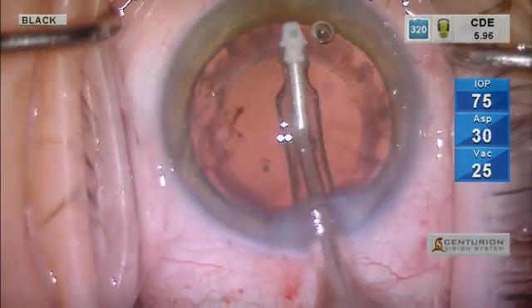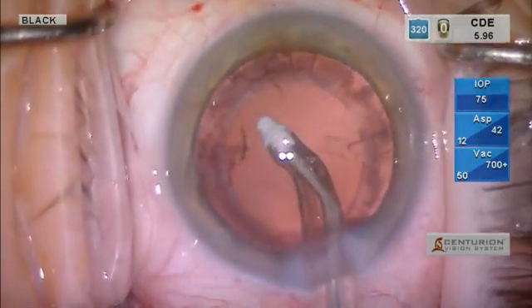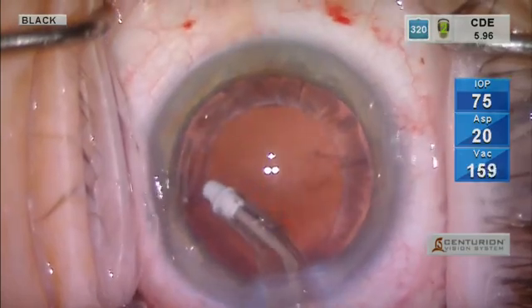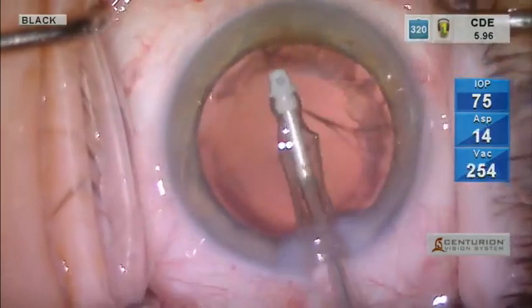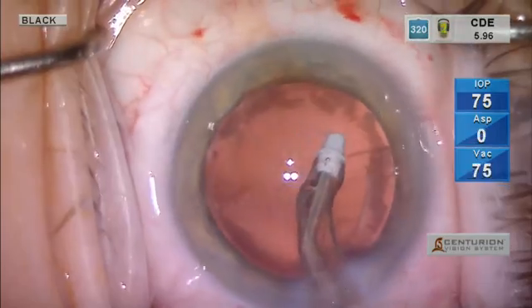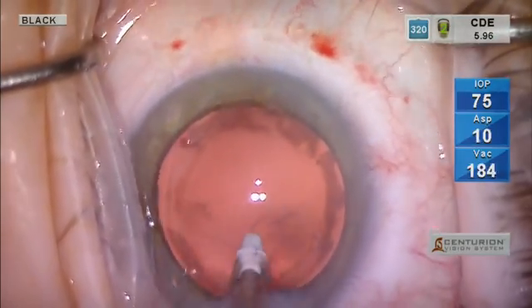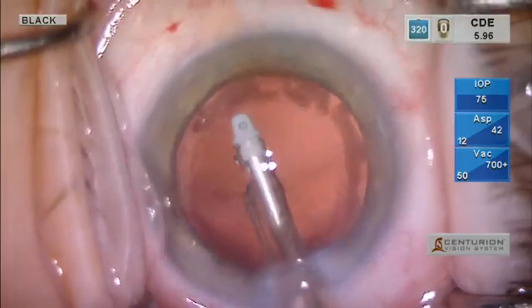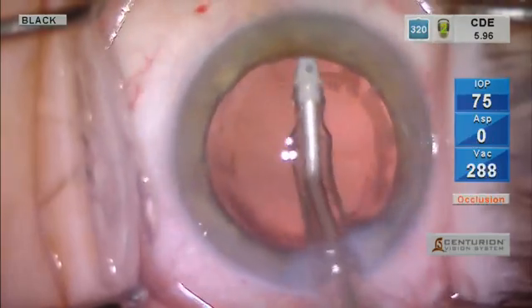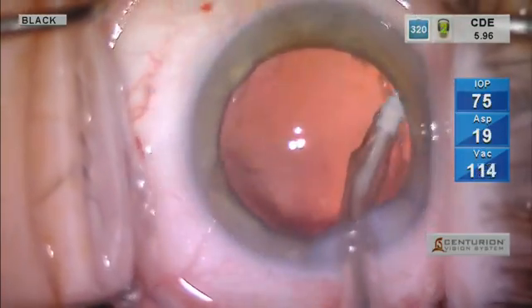This is the polymer tip, which I find tremendously helpful in cortical removal, particularly after a femtosecond laser. As you know, the laser will truncate the anterior portions of the cortex, leaving you no tags really to grab onto. The polymer tip is able to go under the anterior capsule and grasp the cortex very easily. Again, with the Luxor microscope, you see a lot of the material that we never saw before, which is retained on the posterior surface of the anterior capsule.